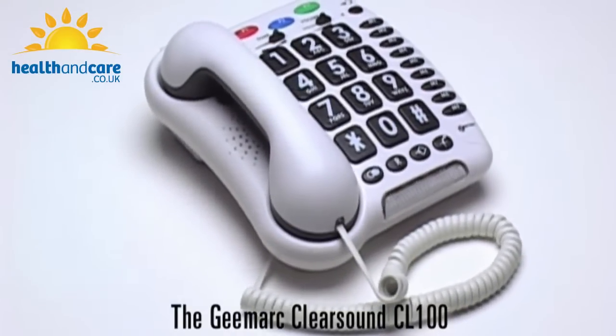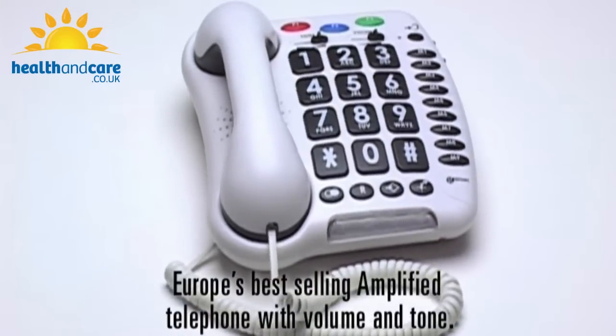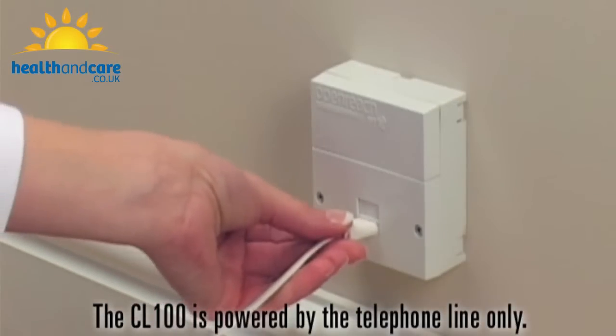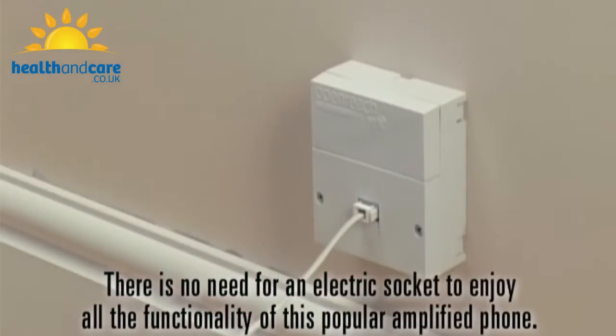The G-Mark Clearsound CL100 — Europe's best-selling amplified telephone with volume and tone. The CL100 is powered by the telephone line only. There is no need for an electric socket to enjoy all the functionality of this popular amplified phone.